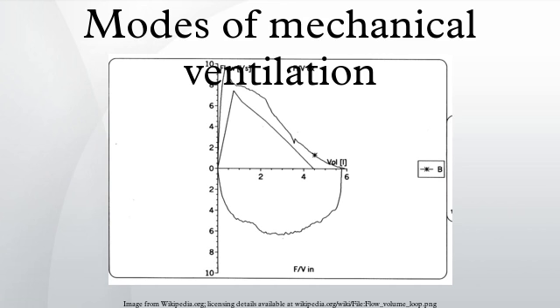Spontaneously controlled. Spontaneously controlled cycling is a flow-sensed mode dependent on a spontaneously breathing patient to cycle. Spontaneously controlled ventilation is typically only in reference to continuous spontaneous ventilation, also called continuous positive airway pressure.